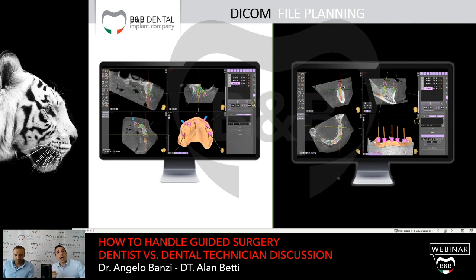In this case, you can remove the sleeve from the collision with the anatomical part, with the soft tissues, and you don't need to open a flap, but the surgical template will be stable on the soft tissues.